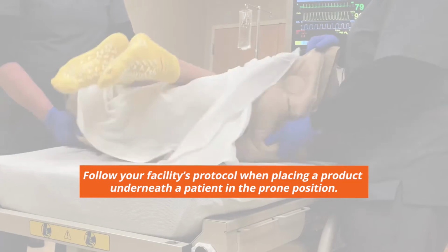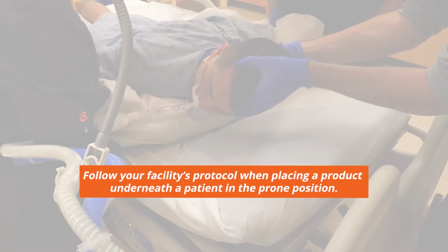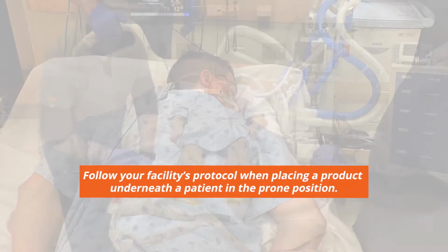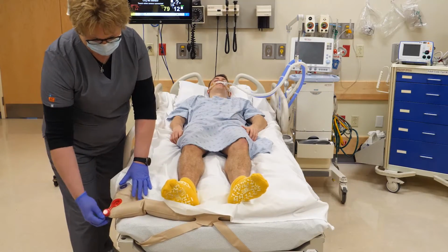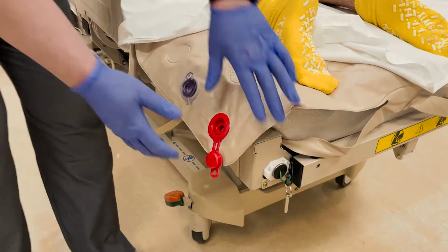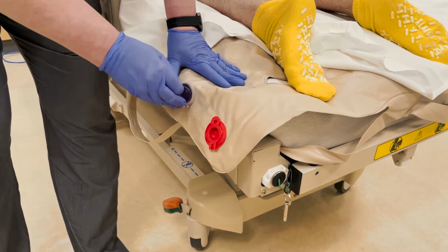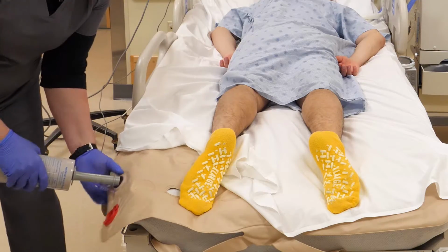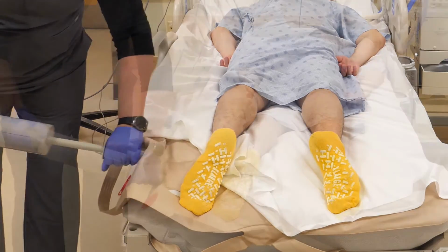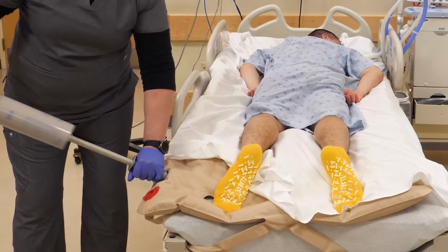The versatility of the eHub Waffle overlay provides caregivers various considerations of use with patients in the prone position, based on clinical judgment and facility protocol. With the patient in the supine position, open the red CPR valve to deflate the Waffle overlay. Once the patient has been placed in prone position, ensure the red CPR valve is securely closed and inflate the overlay. Using the included MAD pump, place the nozzle into the clear valve. Inflate to the number of strokes indicated near the valve on the Waffle overlay.